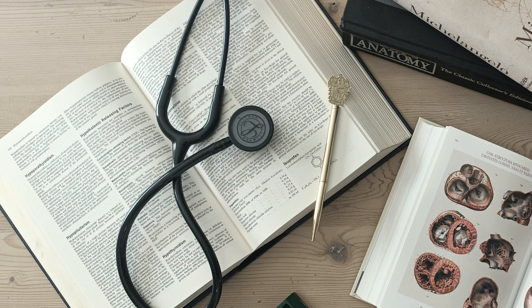Okay, now let's talk about bundle branch blocks. You mentioned earlier that while they're considered conduction defects, they typically don't cause a reduced heart rate. So what are we seeing on the ECG here, and why are they important to recognize? That's a crucial point to reiterate. Bundle branch blocks primarily affect the shape and duration of the QRS complex, not necessarily the overall rate of the heart. Remember, the QRS complex represents conduction through the bundle branches and subsequent ventricular depolarization.